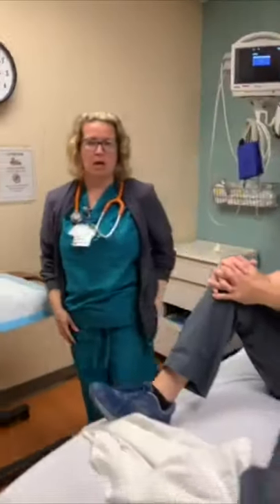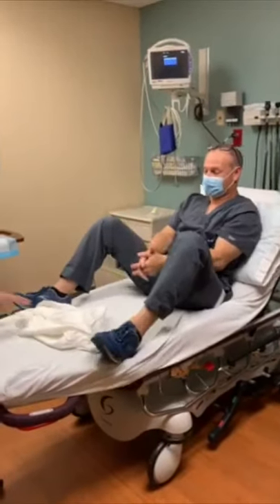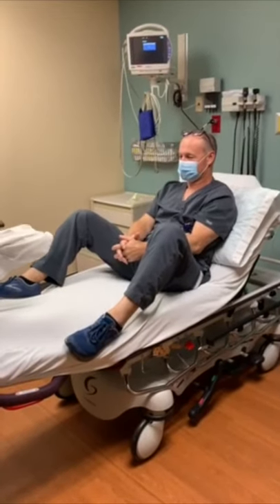Now Tana will demonstrate how to set up the gyne bed, using our patient here who is expected to be 12 weeks pregnant and is experiencing some vaginal bleeding.